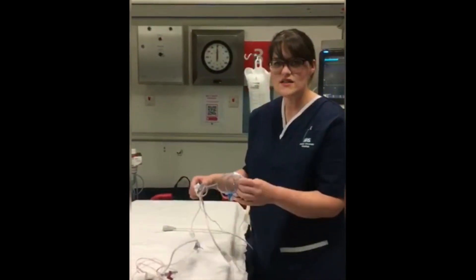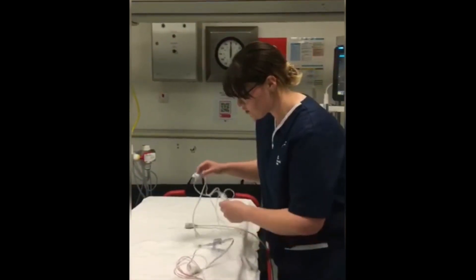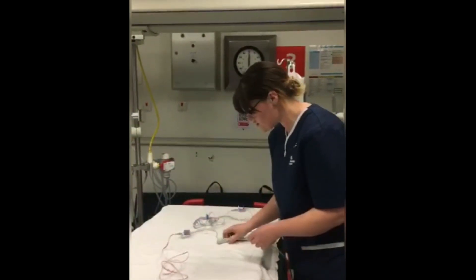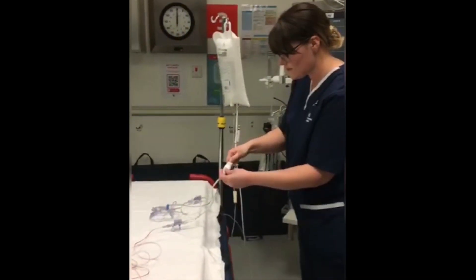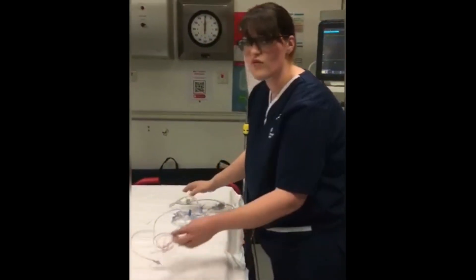In case anyone uses the blue line, always prime this line as well. You will get the same reading — it's just a different colour. Next, pop this onto the monitor by putting the transducer cable in, and then you are ready to go.